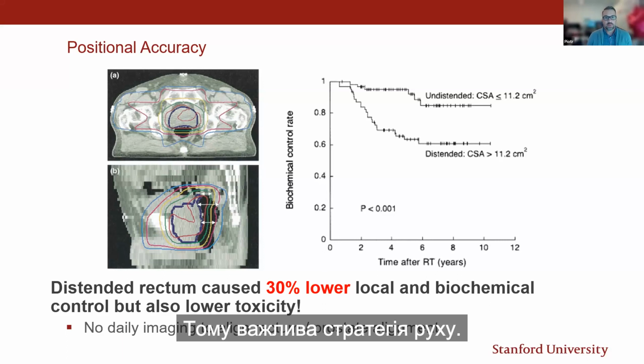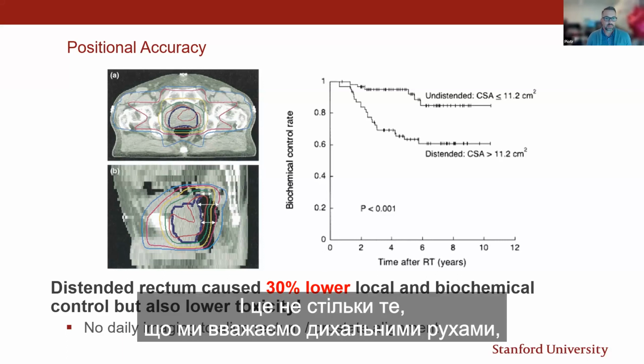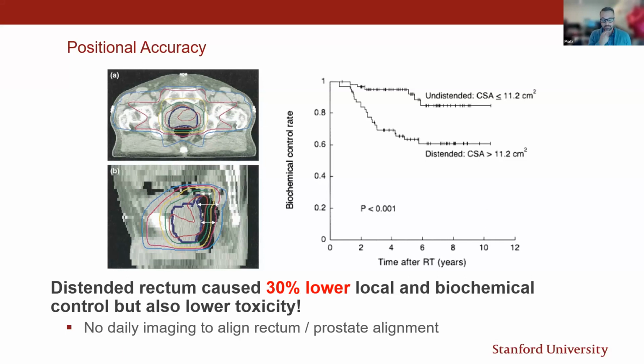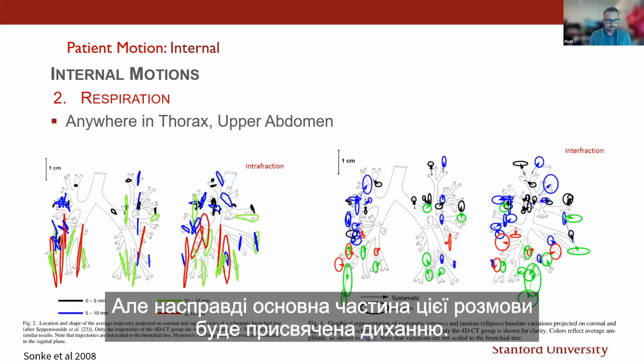So it's a very important motion strategy. It's less of what we think of as respiratory motion management, but it is very important and it has a huge clinical impact. But really the bulk of this talk is going to be about respiration.